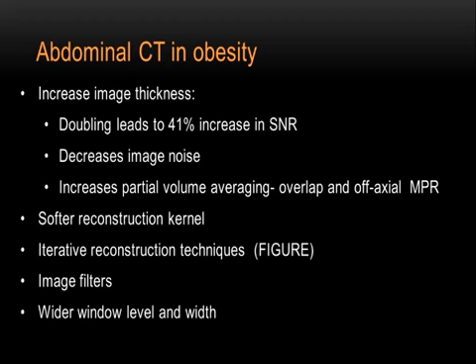Well, you get thin images out, 1.25 or 1.5 or 1 millimeter, put them in a 3D window, do a multi-planar reformat, and you can choose whatever slice thickness you want to, right? Because this would not be allowed prospectively or retrospectively in your usual conventional windows. That helps you cut the noise. That helps you basically remove some of the artifacts, to some extent make them less, although it will increase some partial volume averaging. You will sacrifice some resolution, but if it's an uninterpretable scan at the highest dose that you can get, at least getting something out of it, getting thicker slices makes a lot of sense.